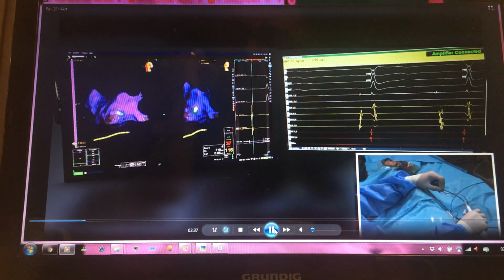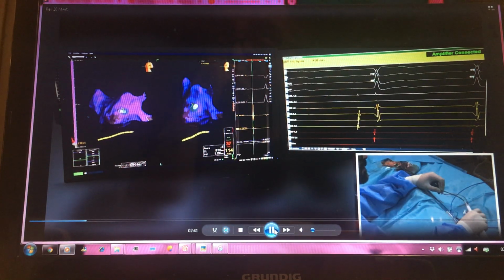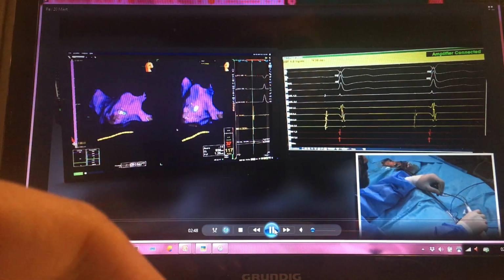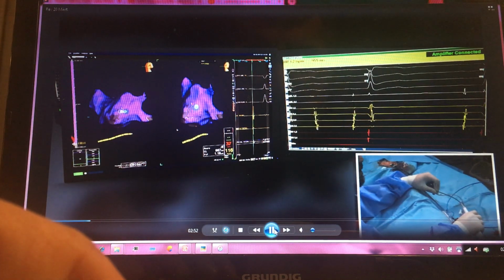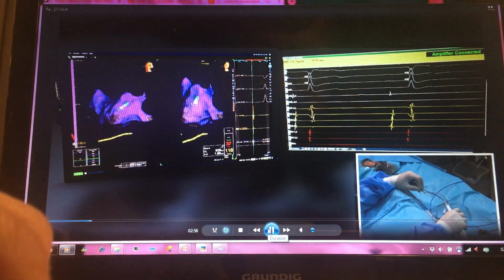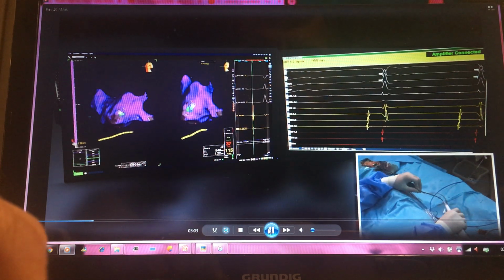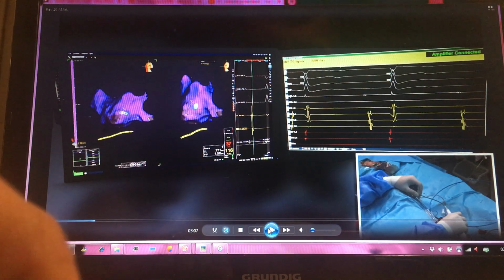Now, we usually start from the left inferior GP during the cardioneuroablation procedure. We will try to demonstrate whether there are any fragmented electrograms at the mitral isthmus site. We try to contact all around the mitral isthmus area. Yes, here we go.